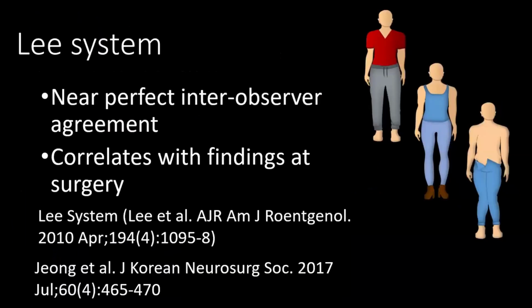So this is also named the Lee system. No conflict of interest with the Lee giving this talk completely differently. And it actually is very concordant with the way we think about the canal stenosis for the other Lee classification system. It's also very reproducible, and it does correlate with findings at surgery.